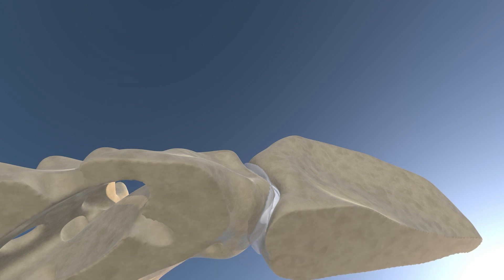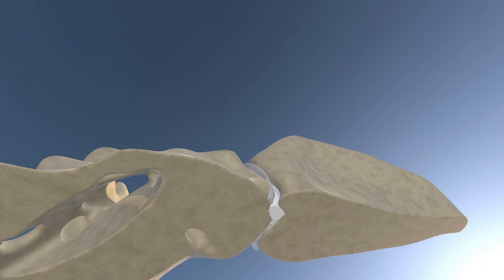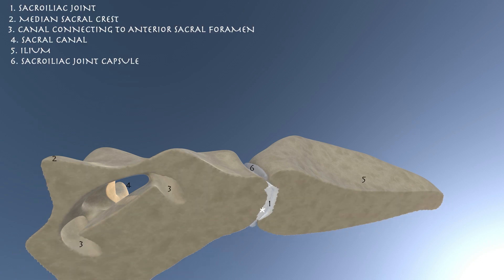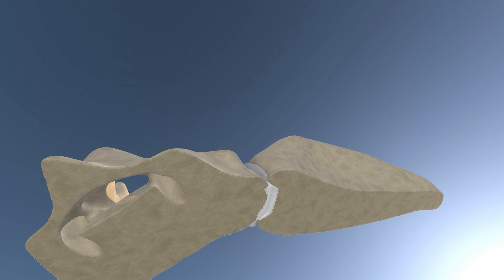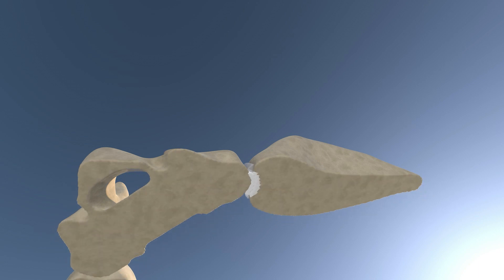Cutting further cephalad, we're now into the sacral iliac joint and we no longer see the posterior sacral foramen — just solid bone going across. Going further cephalad again, you appreciate the posterior sacral foramen and the sacral iliac joint, as well as the connection between the anterior and posterior foramen. These connections splay laterally outward, which is why you don't see them fully in one view.